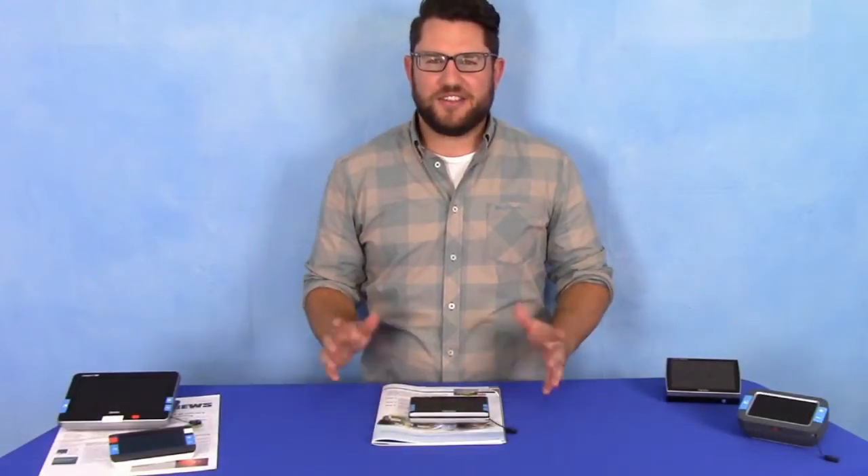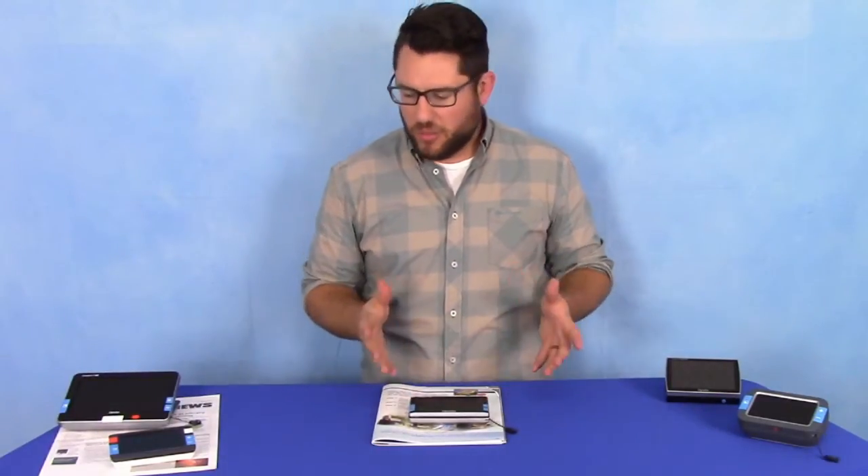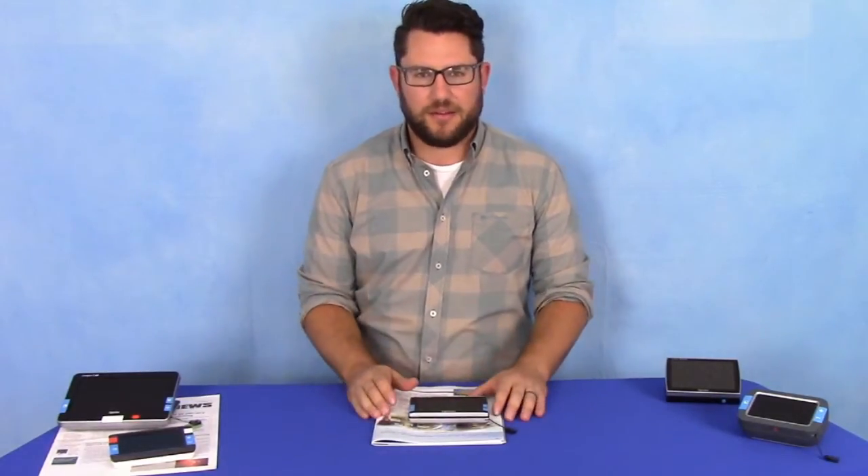Hey guys, Tyler here with Optelec. In this short video I want to go over quickly the Compact 5 HD. This is one of five of our Compact HD range — this is the five inch model, hence the name, the Compact 5 HD.